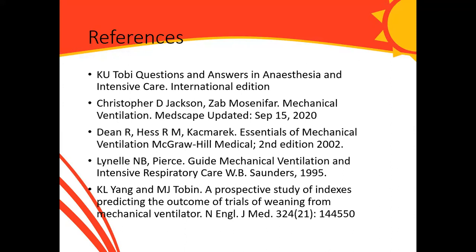There's also a way you can measure the patient's tidal volume on a T-piece, using inspiratory spirometry. The patient breathes into the spirometer and it measures the tidal volume. And you do it after you wean the patient off sedation as well. Yes, obviously, you want to do Tobin's index after weaning the patient off sedation.